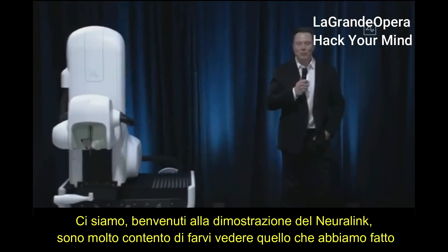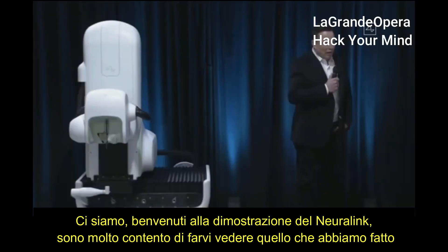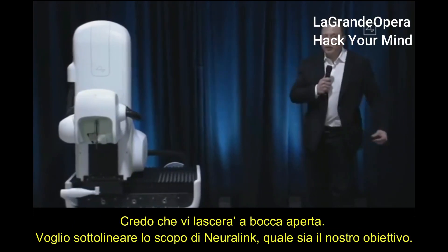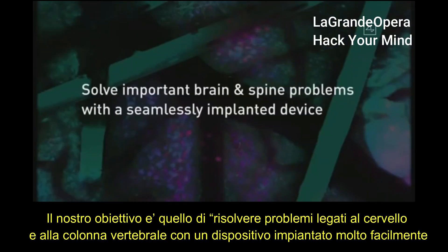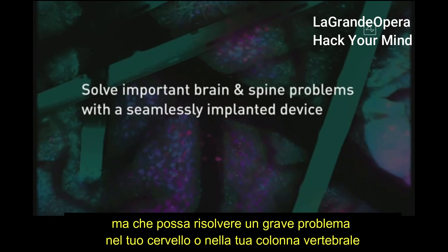Welcome to the Neuralink product demo. I'm really excited to show you what we've got — I think it's going to blow your mind. The purpose of Neuralink is to solve important spine and brain problems with a seamlessly implanted device. You want a device that you can basically put in your head and feel and look totally normal, but it solves some important problem in your brain or spine.